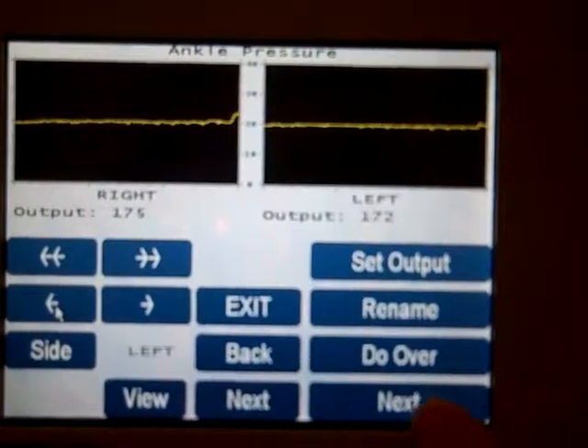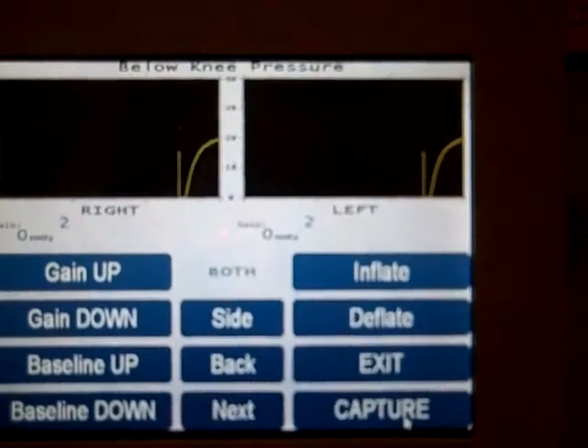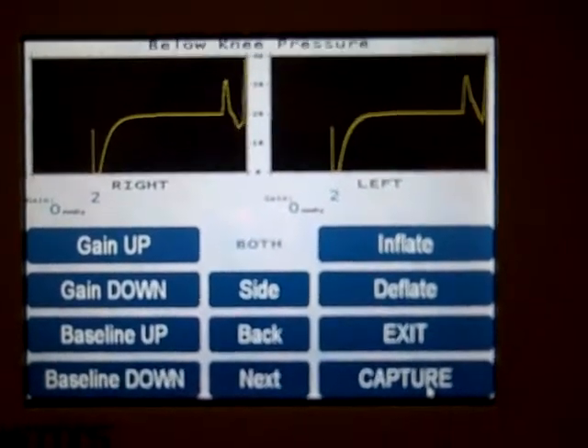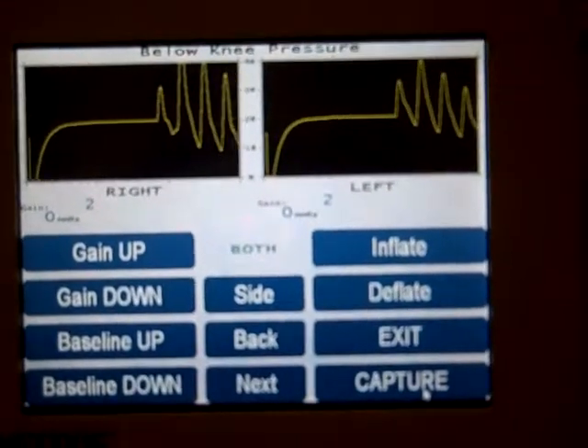When you're finished, press next and then go on to the calf or below-knee pressures. Wait until the waveforms become pulsatile again.